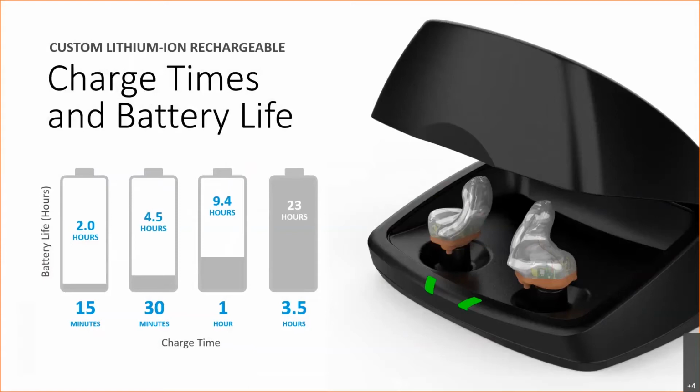So my recommendation is that you keep one of these in your clinic. So if you do have a patient who happens to come in for programming adjustments and they forgot to charge their hearing aids for a couple of days, you can just put them on your charger, have them take a seat in the waiting room for 15 minutes, and then you'll have enough charge to make your needed adjustments.